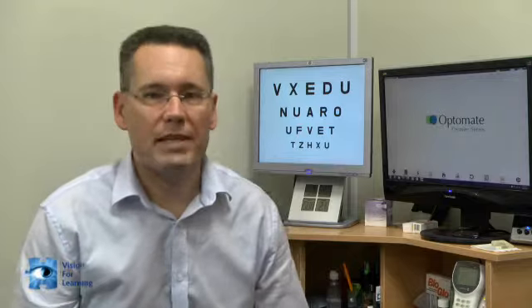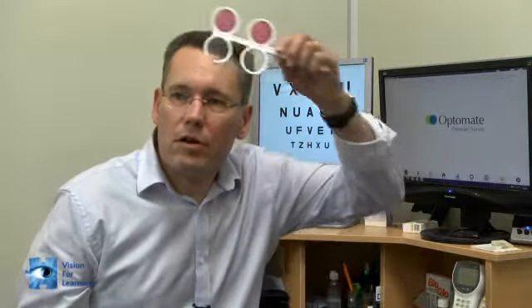Finally, if a student does appear to have a problem with convergence, then this is something that may be improved by holding up the reading lenses that come in the kit. So hold them in front of their eyes and try repeating the test, moving the metal wand closer towards their eyes. If this improves the convergence, this may suggest that glasses would be helpful and may also indicate that there's an underlying focusing problem associated with their difficulty converging.